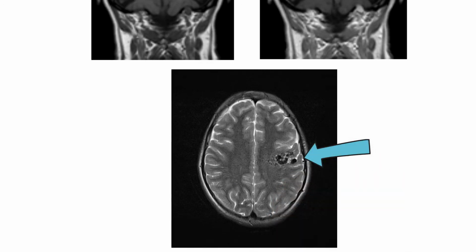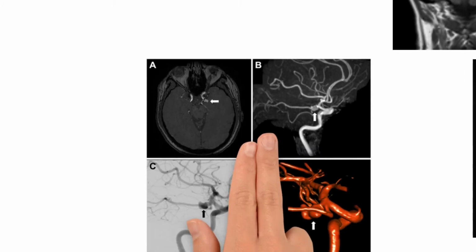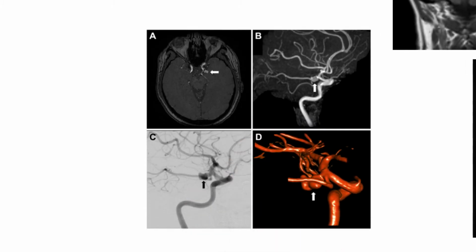Since blood travels through the vessels, when the magnet lines up the dipoles and then records the relaxation time, the blood that was magnetized is no longer in the vessel, but has moved through the vascular system, so blood vessels tend to show up as black spots. The MRI can be used to image blood vessels, though, using contrast in the vascular system.